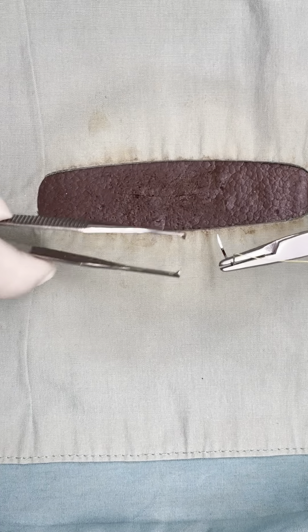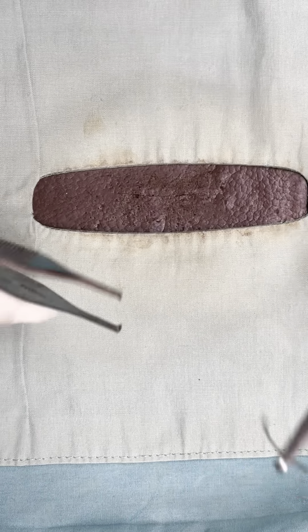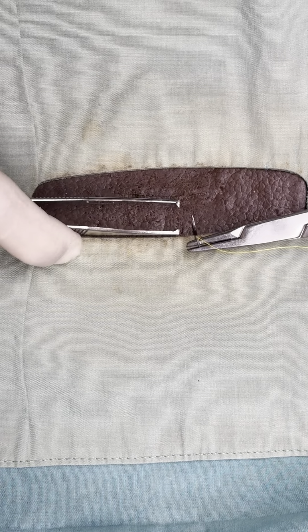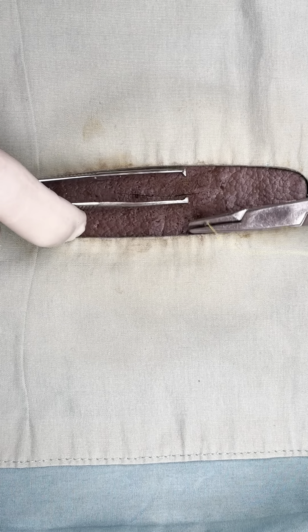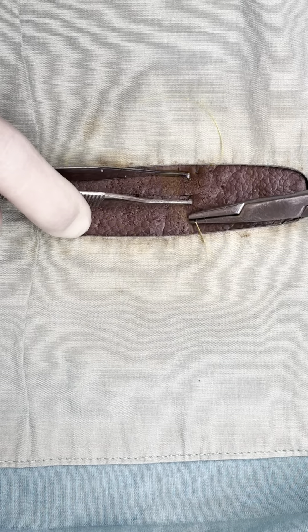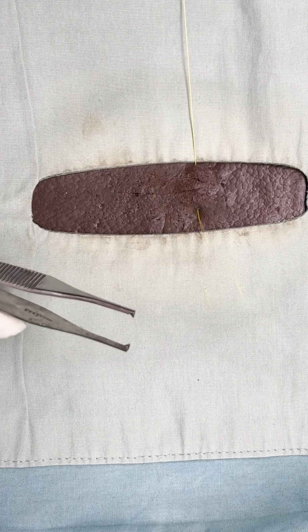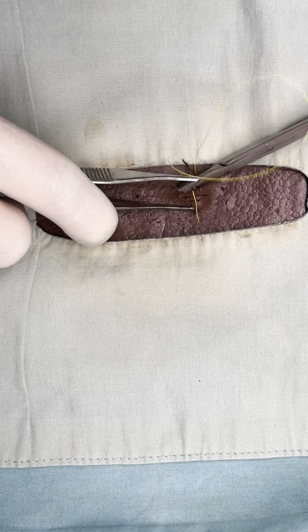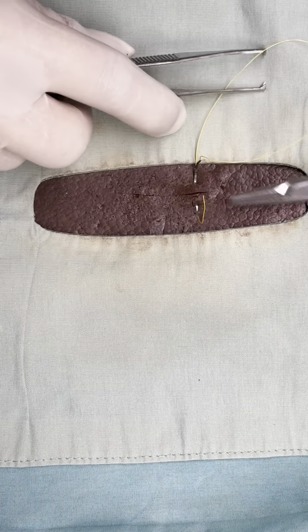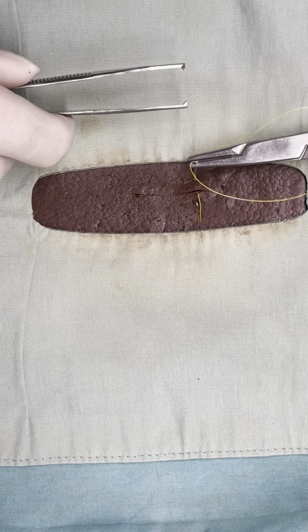Now we'll do the vertical mattress. We're going to start on the side farthest from us and take a little bit bigger bite than we normally would, then exit on the side closest to us. We'll pull and leave about two inches. Now we're going to redirect our needle to enter the side closest to us, directly over top of where we previously exited, and then exit on the side that we previously entered.